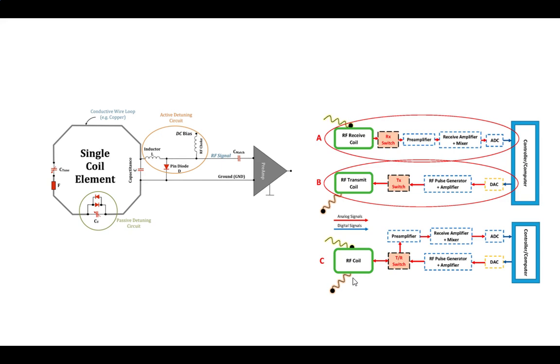You do want a separate disconnect though, because you don't want it to go through your preamplifier or create a huge spike even with the thing detuned. You want to switch so it's off, because you don't want that going through the amplifier and propagating down the line, a gigantic, ever-increasing wave of destruction.